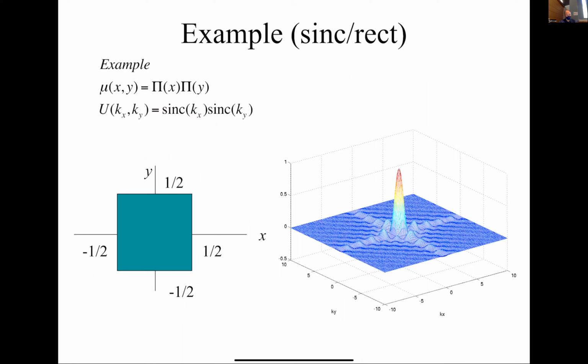So for example, if our object was this 2-dimensional rect, then the MR signal as a function of Kx and Ky, we expect to get a 2-dimensional sinc. And then the question for MR is how do we collect this data? What we discussed last time is the most simple way is Cartesian. We acquire one line, maybe this line first, going through in time.